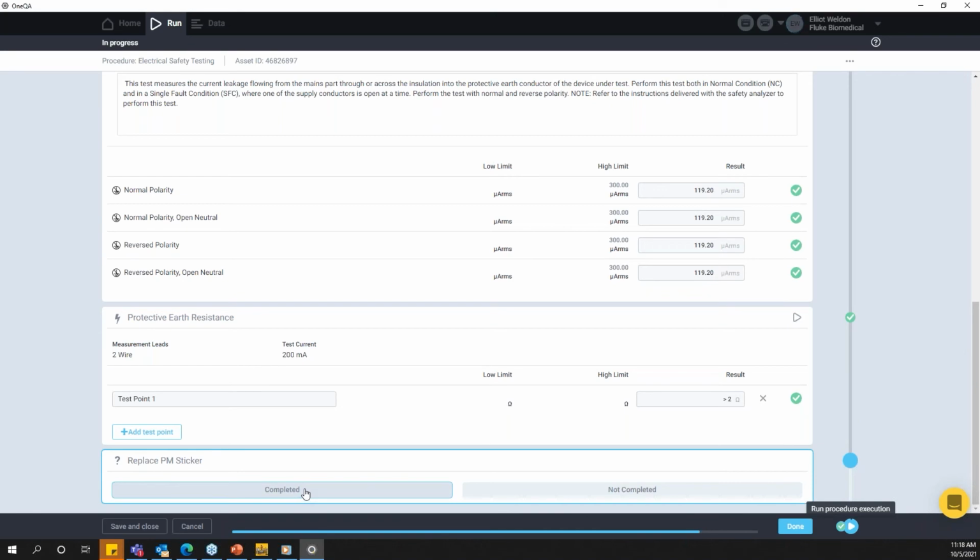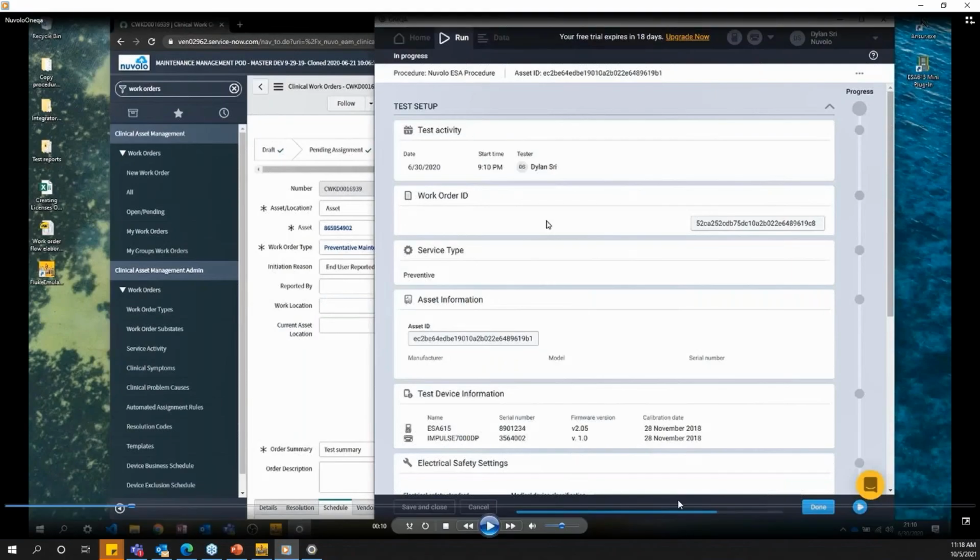So now I'm going to select completed. And when you're done with the procedure, we select done here. And we're going to go back to my video that I have queued up.